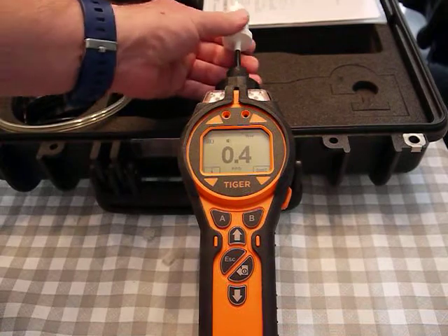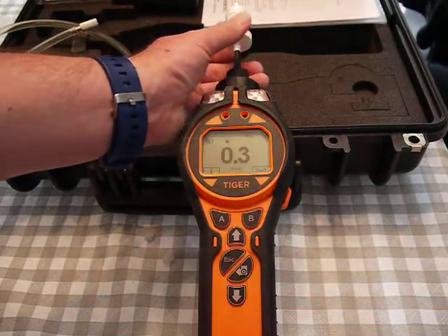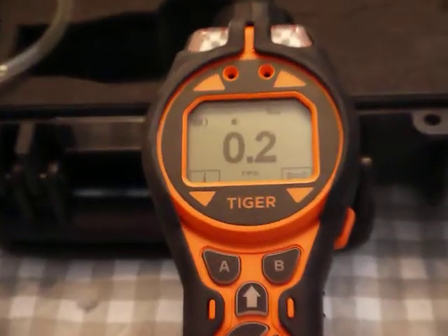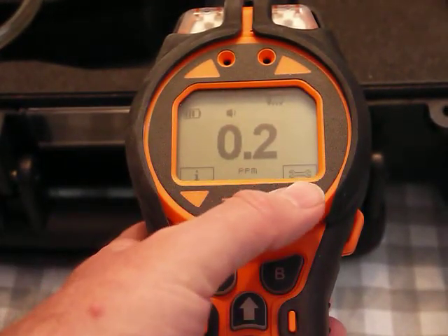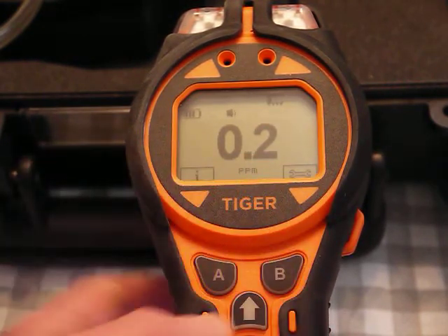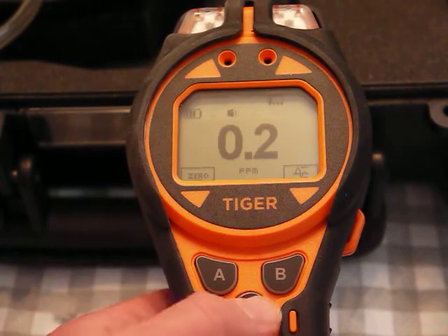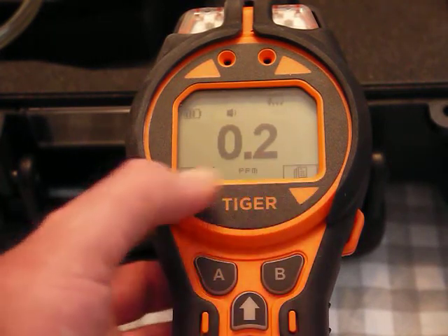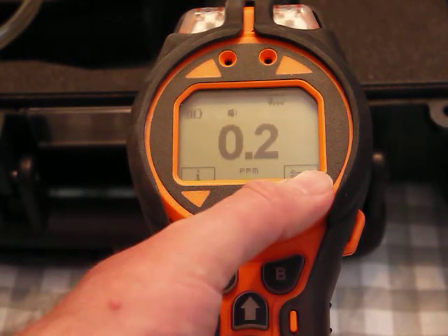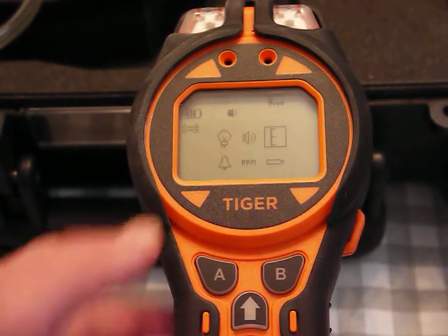I pop the caps off and attach the carbon filter onto the meter — you might even see the reading drop as it's pulling through the carbon. It's actually pretty clean in here. There's a little wrench icon shown in the menu, and I'm looking for it using the up/down buttons.